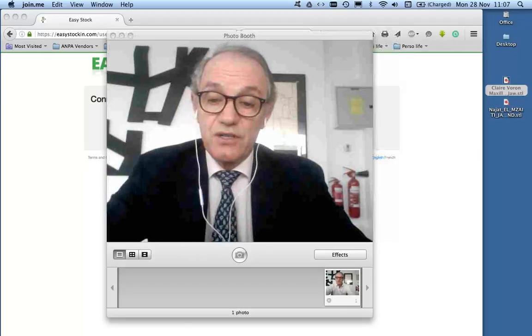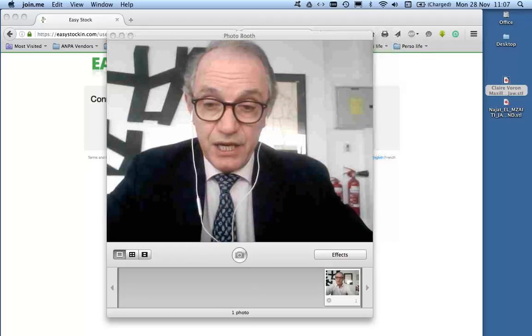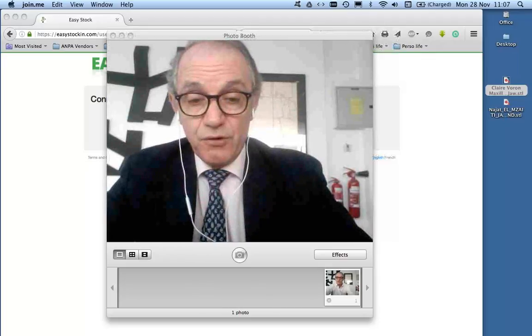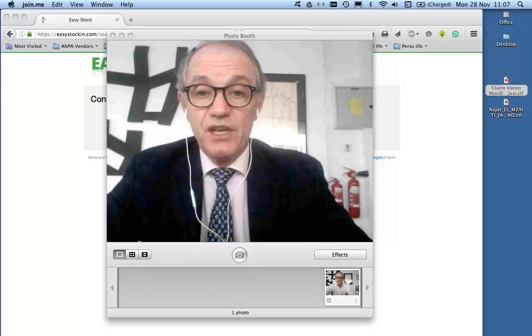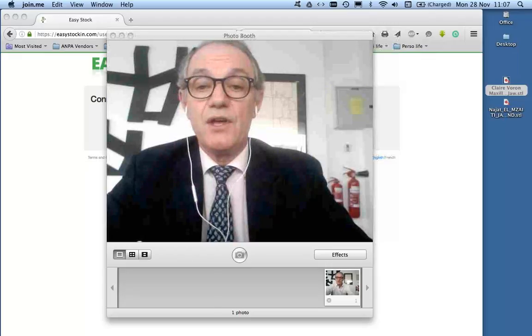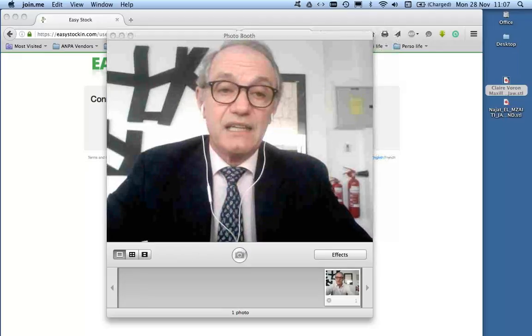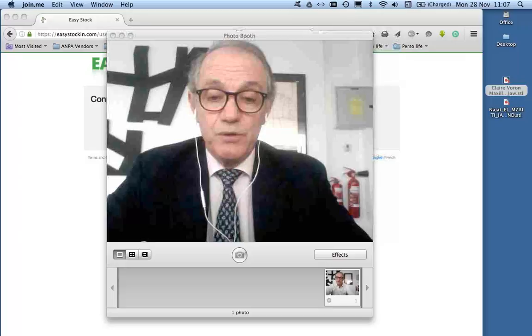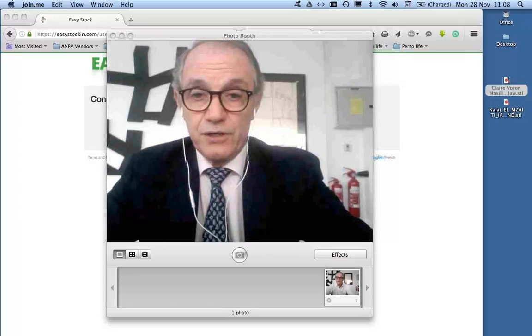Because of that, you're going to work in a more secure way for your patients, and also you're going to save time and energy because you will get access to all this information, and you will not lose your time taking impressions again and again if it's not really required. This is what we call digital communication with the dental lab. And this is the future of all of us. No need for papers anymore, but we need to have a strong basis on which we can work.